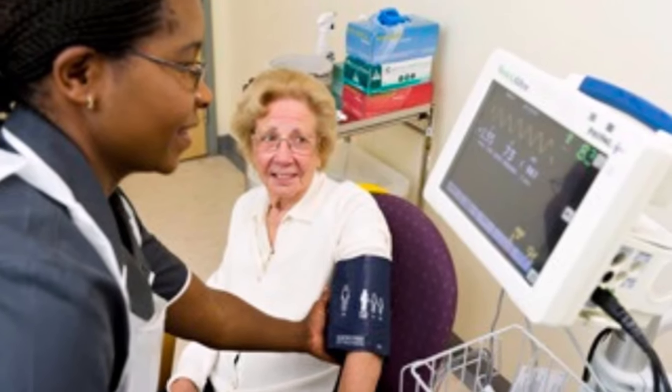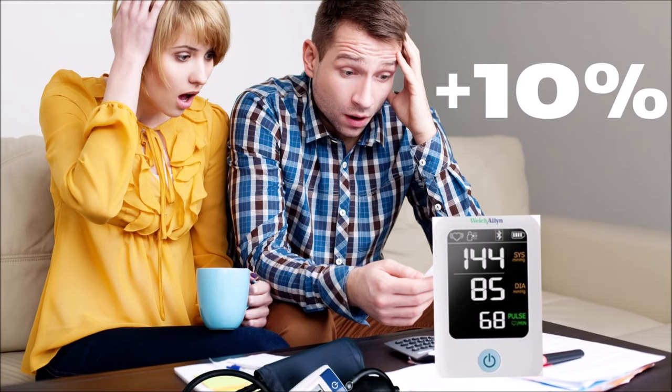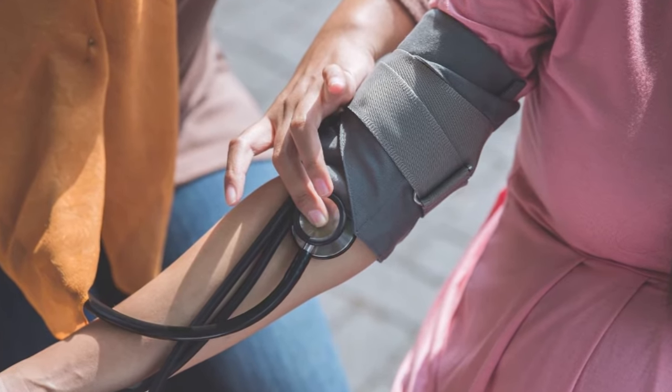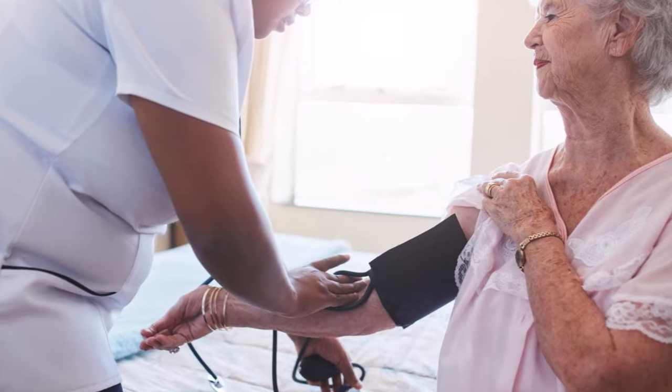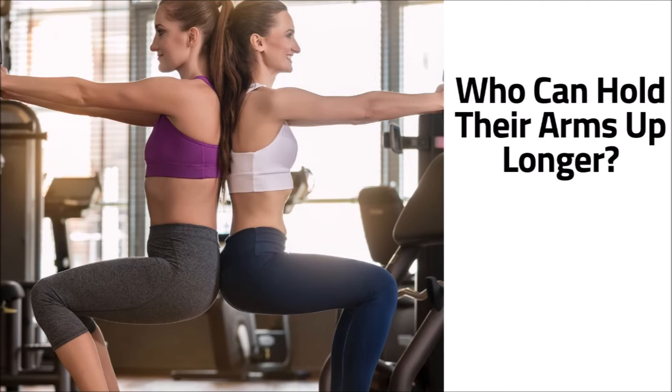If your arm is hanging straight down parallel with your body, your blood pressure will measure higher. And that one thing I mentioned earlier, which can raise your blood pressure by 10% even though the cuff is at the correct level, is having your arm unsupported. When your arm is unsupported, it forces you to use force — an isometric exercise — to hold your arm in place, which can raise your heart rate and blood pressure.